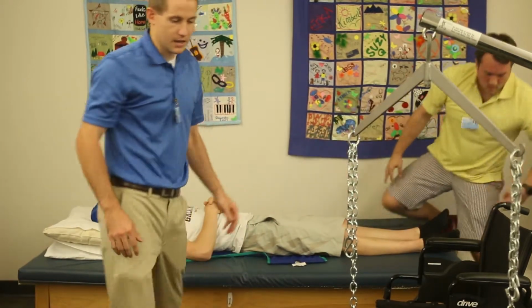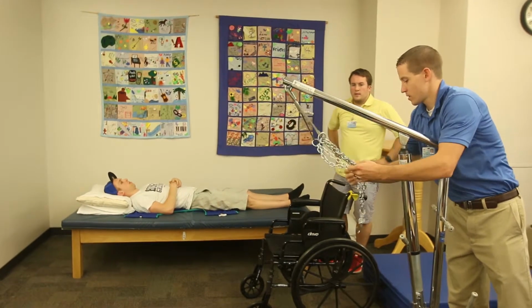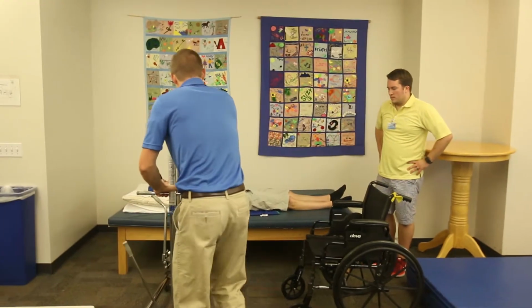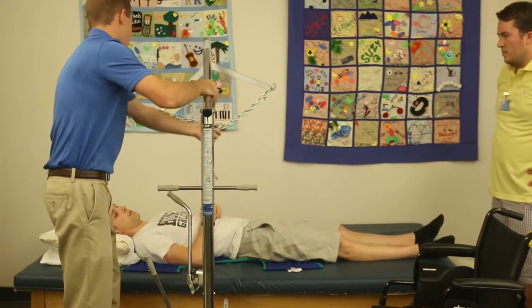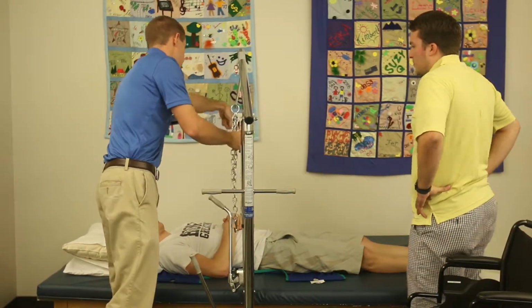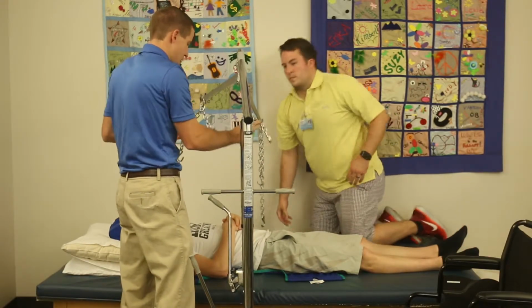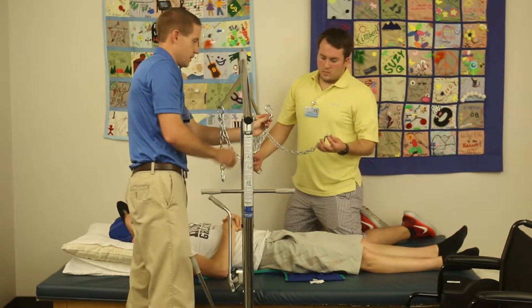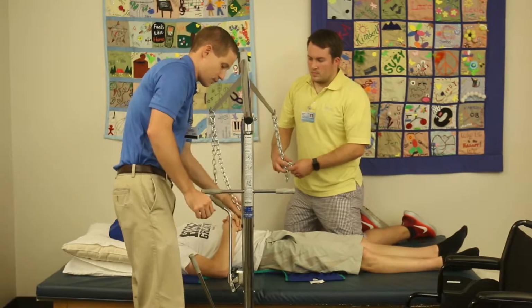Okay. Let me get this guy in here. Gotta make sure these chains are out of the way so we don't give you any discomfort by those chains up above you. I'm gonna bring this right over the top. Okay, Rich, so I'm gonna have you come up on this side again with me. And now as I lower this down, there's a long chain and a short chain. The long chain needs to go on the bottom, but they've got a little hook. That hook needs to go in and away from the patient. So that way it doesn't give me any discomfort as we raise them up.